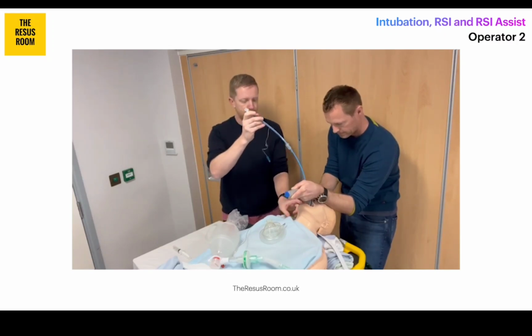Great, so the bougie is through the cords and I've clearly verbalised that to Simon. Now again, if this was a video laryngoscope, he could have been watching as well and confirmed that the tube had gone through the cords. And after I gave him the go-ahead, Simon has slid the tube over the bougie and he's starting to thread it down towards the mouth.